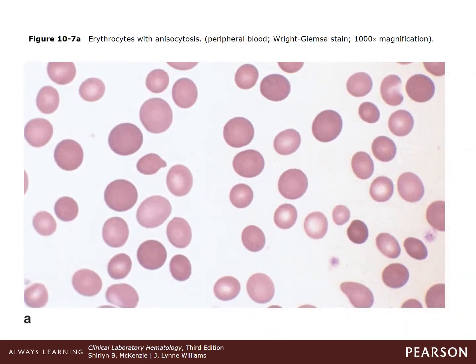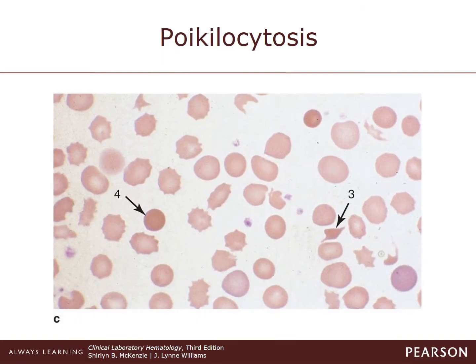Here is a peripheral smear showing anisocytosis — you can see different sizes present, including microcytes, normal cells, and macrocytes. Now we will discuss the different shapes, or abnormal shapes, that can be seen on the peripheral smear. The term is called poikilocytosis, and we will discuss each individual abnormality due to its shape.